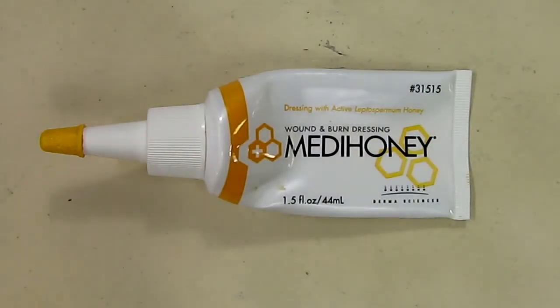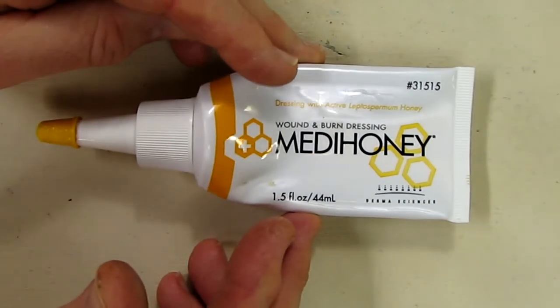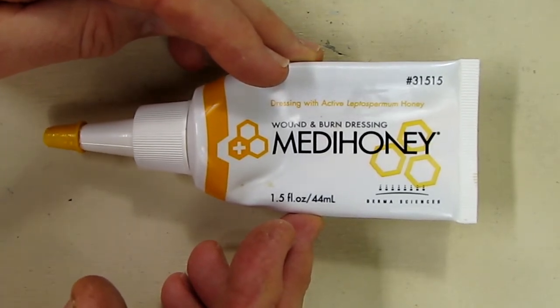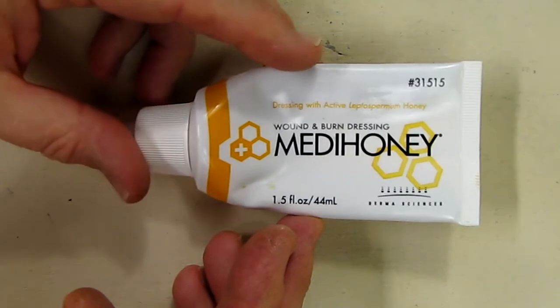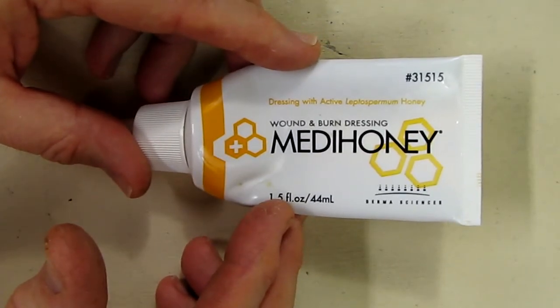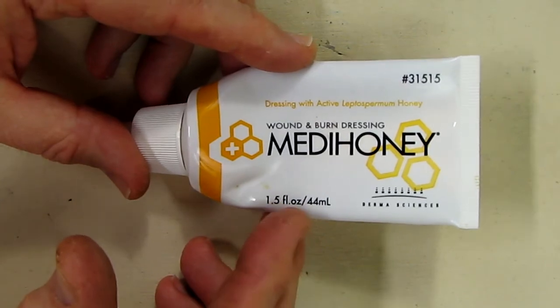Hello again, Robert Veach here. This is my video review of a product called Medihoney. I've used this product for several years now. This is a very effective thick kind of paste that you put on any kind of wound that you want to accelerate the healing of. It's actually made with a very special kind of honey — I think it's made in Australia. It's very unique.